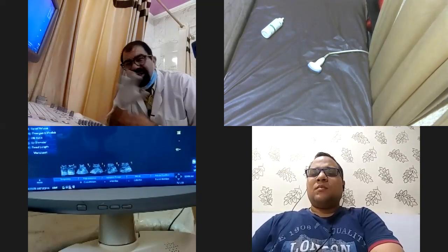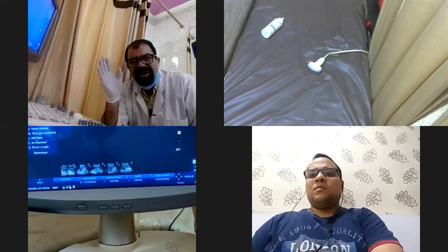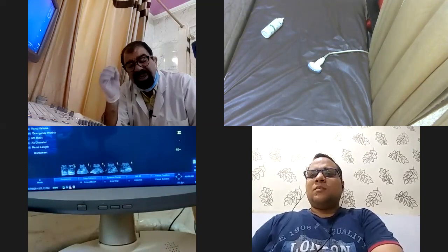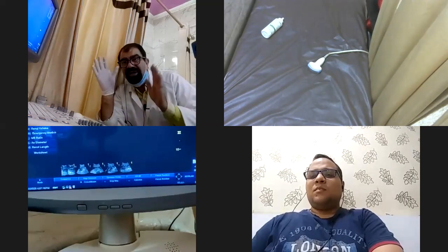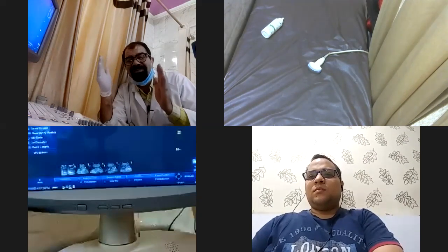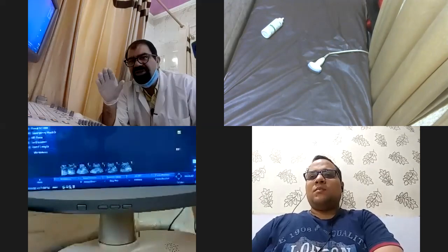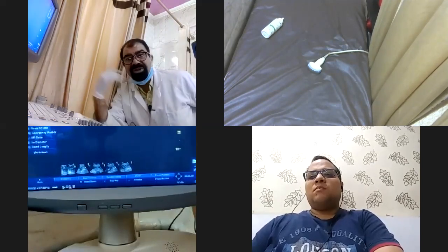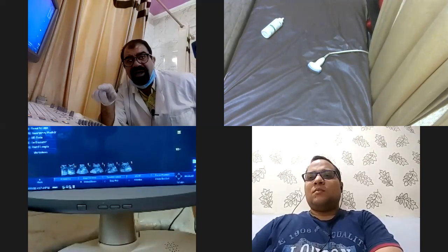So the point is that when you are seeing a slow flow somewhere in the body, for example, you are differentiating an RPOC from a blood clot, you have to adjust the PRF, pulse repetitive frequency. So the important point is that the frequency and the pulse repetitive frequency are not the same. PRF has nothing to do with the frequency, okay? Now, setting a frequency depends on the area of interest and the habitus of the patient. If the patient is obese, I have to decrease the frequency, and that will be at the expense of resolution.